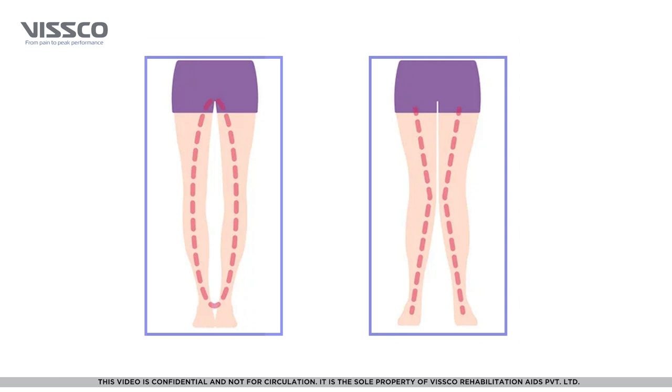It is important to note that the hinge for a varus deformity comes on the inner side of the knee, and for a valgus deformity it comes on the outside of the knee. The brace for the right side and left side are different for this product.